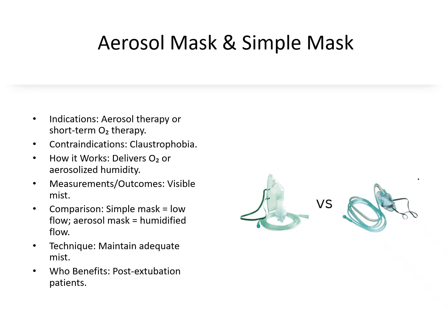Simple masks are low-flow devices, while aerosol masks provide humidified oxygen. Techniques include ensuring there is always visible mist. Patients benefit from these after extubation or surgery.